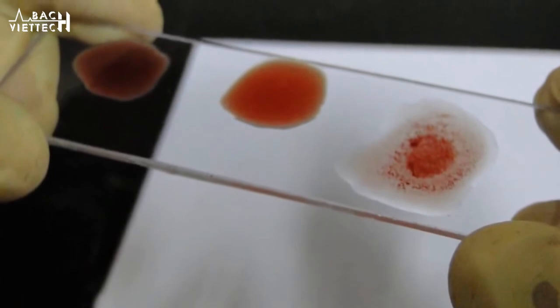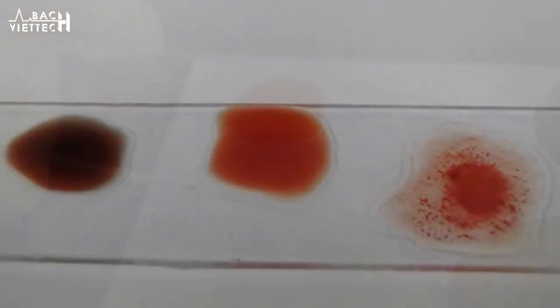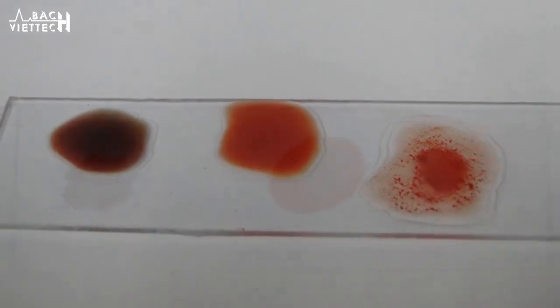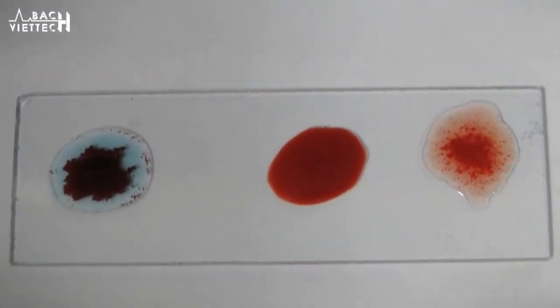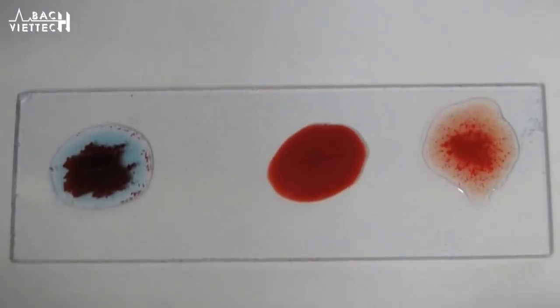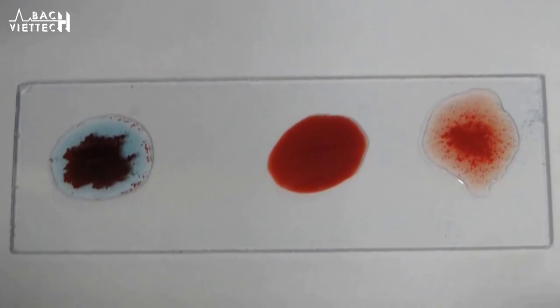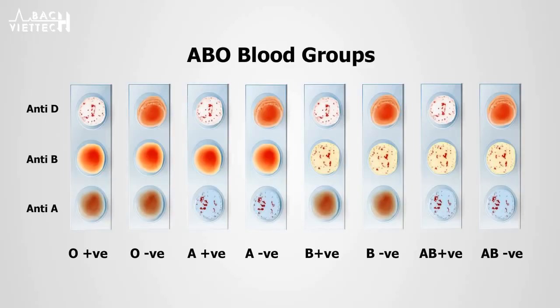When RBCs carrying one or both antigens are exposed to the corresponding antibodies, they agglutinate — that is, they clump together. For example, in this slide, agglutination occurs on the first and third drops, which corresponds to antigen A and the Rh factor. So the blood group is A positive. Thus we can identify the blood group by noticing the agglutination on the corresponding drops.